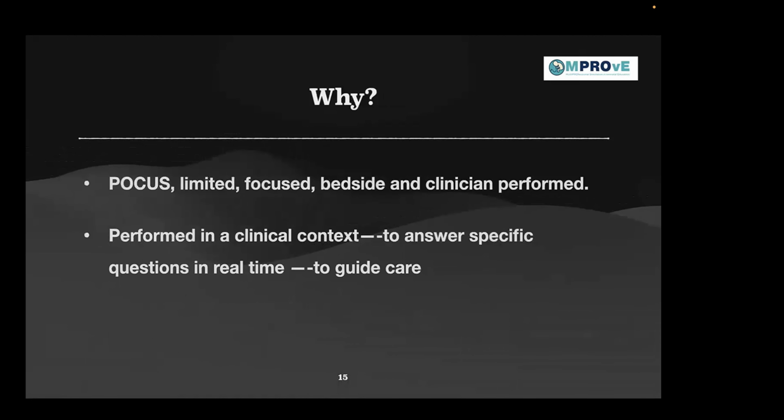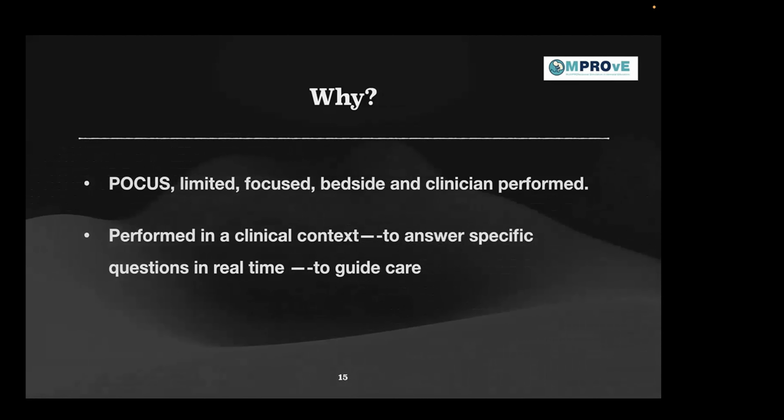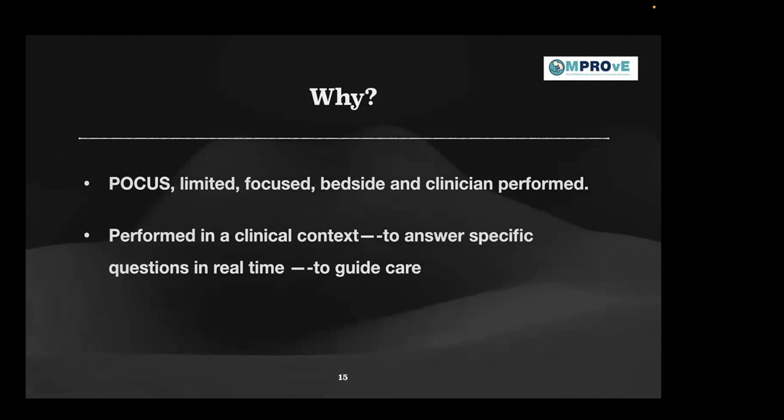Right. So I think we all know why we do ultrasound scans, and I'm talking about point of care ultrasound, which encompasses the lung ultrasound as well. So it's very limited. It is very focused, and it is always done by the bedside. So you don't have to move your babies or patients anywhere, and it's always done by the clinicians. So we are trying to find an answer to a very specific question when we are doing a point of care ultrasound, and so is the lung ultrasound as well.